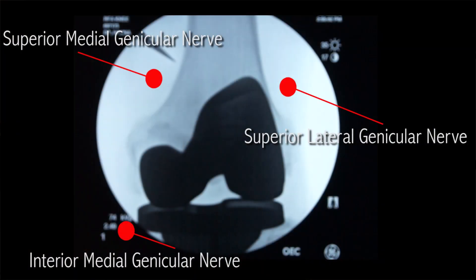Patients who do the diagnostic block first will have their genicular nerves numbed to see if they get good relief. If they get relief of at least 50% or above, that means they are a good candidate for radiofrequency ablation. This patient had a good response to the diagnostic block, and today we are performing the radiofrequency ablation.